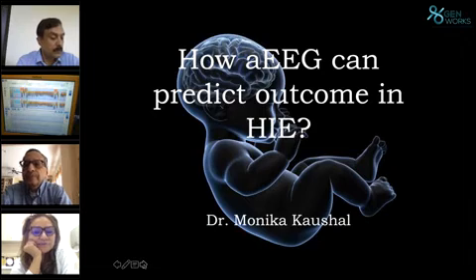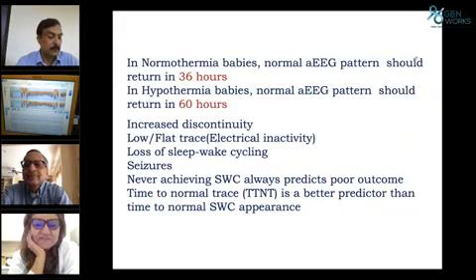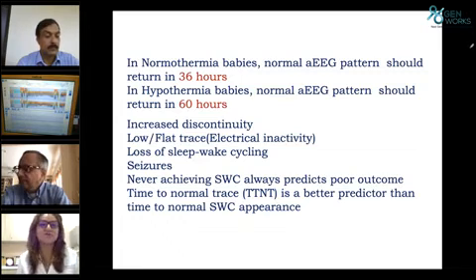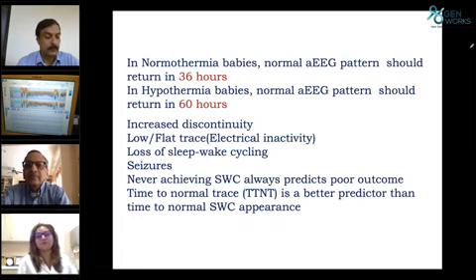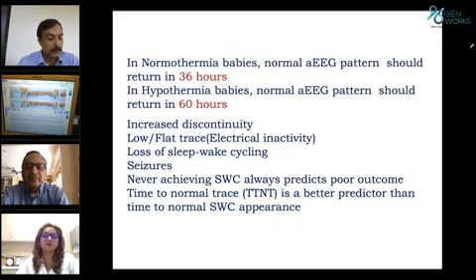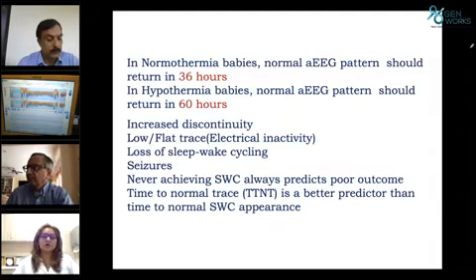Yeah, okay. So this is what Dinakar was telling. This is not the only thing we are looking at EEG for, but this is one of the most important things I feel. So we should be talking about it because once we are seeing any baby, especially with asphyxia, we need to know and tell the parents what is going to be the outcome and prognosis for this kind of baby. So that's a very important thing. And I would say this aEEG is one of the tools when you are assessing a baby neurologically.